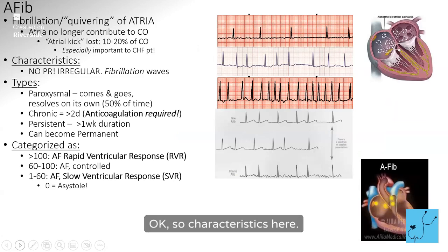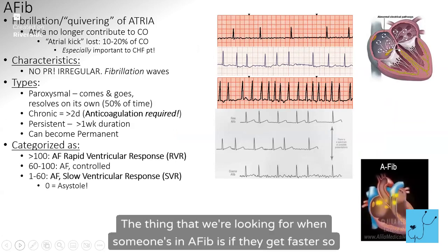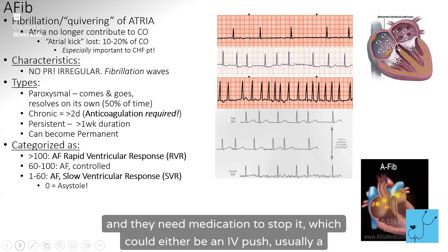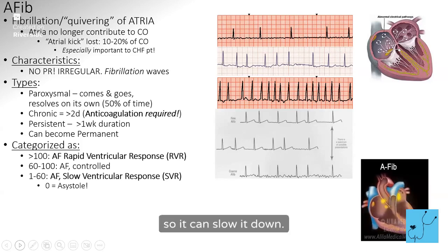Okay, so characteristics here. We've already pointed out a couple of AFib rhythms. The thing that we're looking for when someone's in AFib is if they get faster, so they have AFib with RVR. That's AFib that is greater than 100, and it usually gets a lot higher than that, like 120, 160. They need medication to stop it, which could be an IV push, usually a Cardizem, diltiazem, or a calcium channel blocker. It interrupts those signals, and so it can slow it down. Sometimes they end up on a drip.